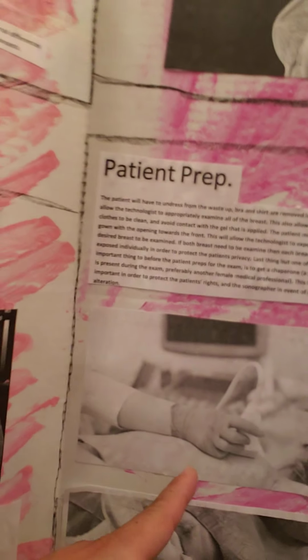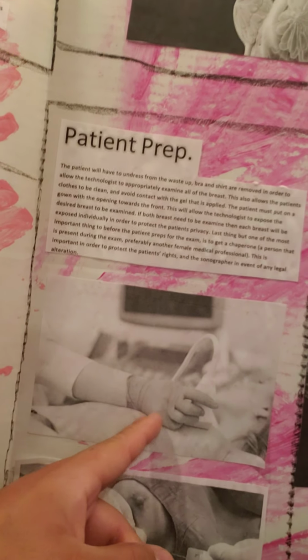This is how we scan the breast right here. This is the type of transducer that we use, which is called the linear array. It is what we call a high frequency transducer. The reason we use that one is because for structures closer to the skin, it gives us better resolution. The images are more clear. There's more detail to the tissues around it.